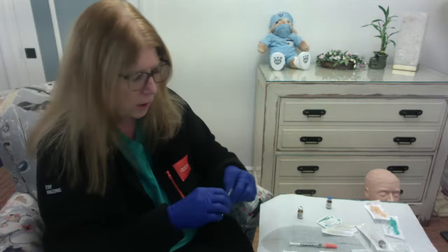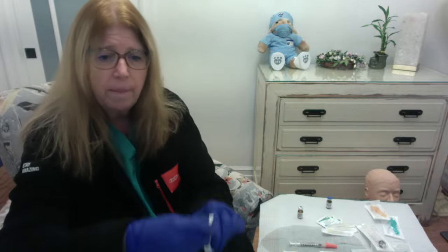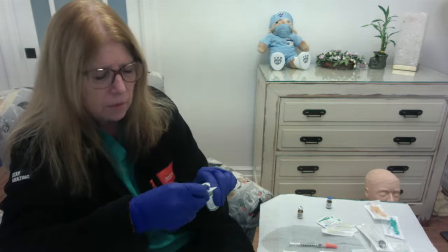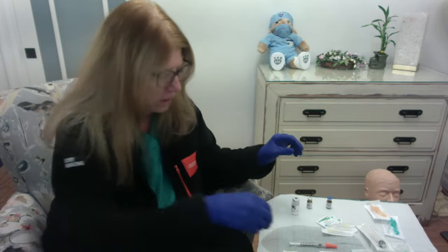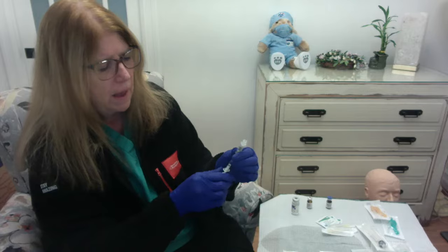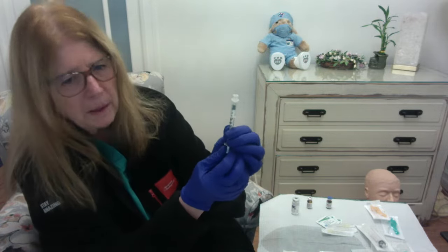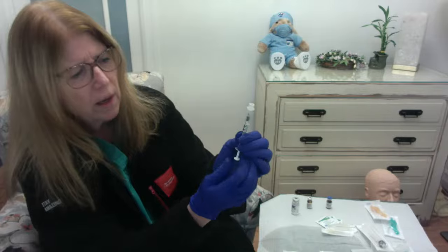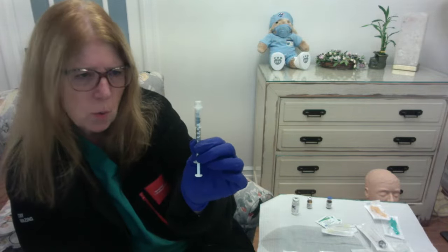But I have to do a clean, so I have an alcohol pad. I'm going to do my 30-second scrub the hub. And then, of course, I'm going to allow that to air dry. Then I'm going to take my syringe. We've got the cap off. And I said, what did I say, 20 units of insulin? So I'm going to pull back that plunger until I get to the 20. Again, that top black line has to be on the 20.